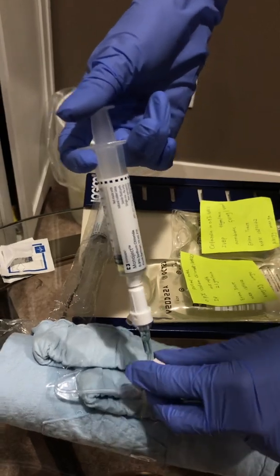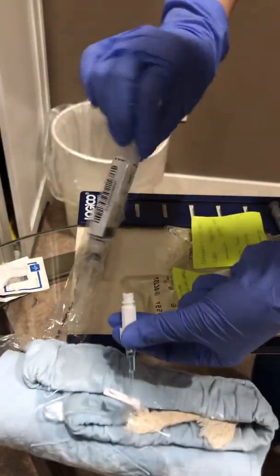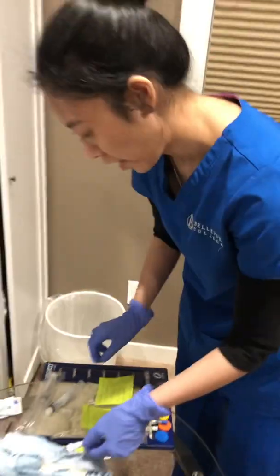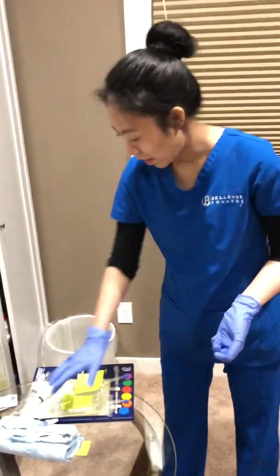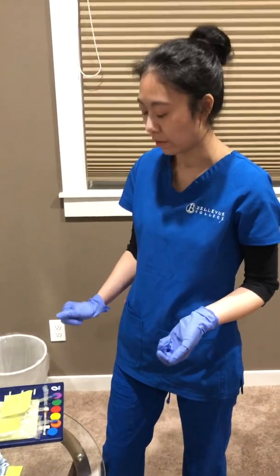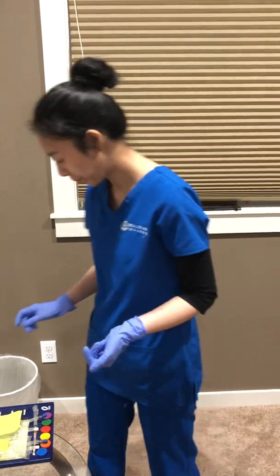Good. Okay, locked. Okay, all right. Your IV site looks good. And then now I'm going ahead to give you some sodium chloride, okay?